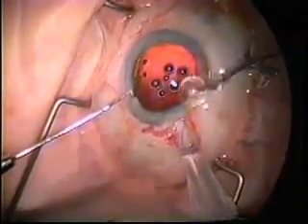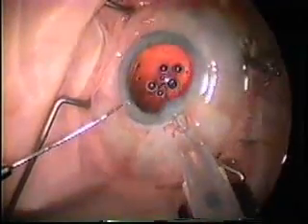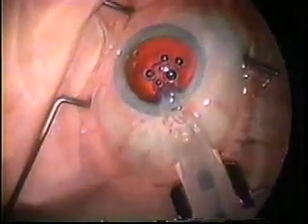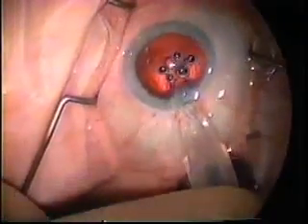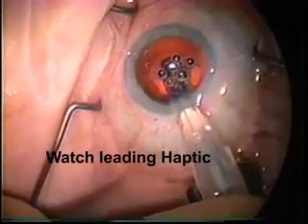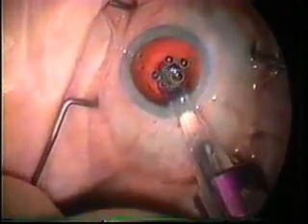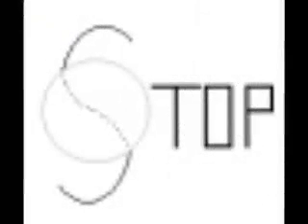As you place the intraocular lens, one must be careful that it's placed right side up. You have to pay attention to the way the haptics look. Pay attention here as the leading haptic comes out — you'll see we have a problem. As the haptic comes out, it's upside down. When it looks like an S, stop.